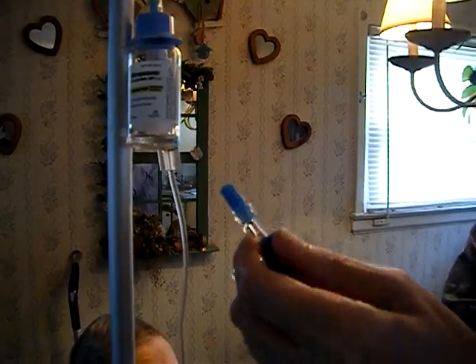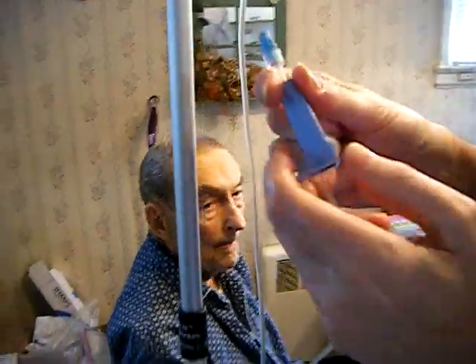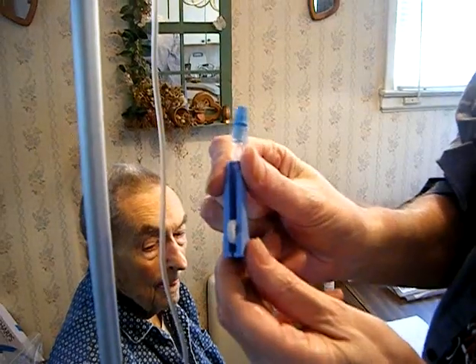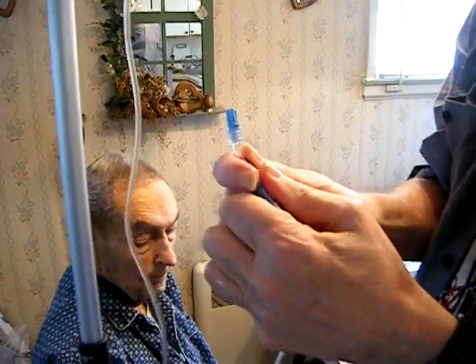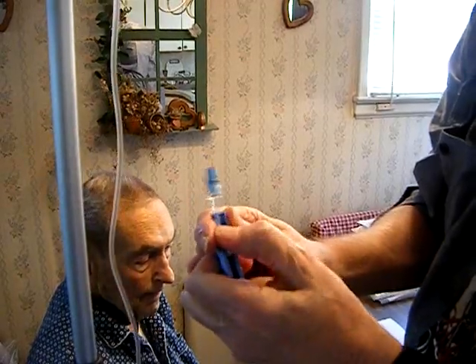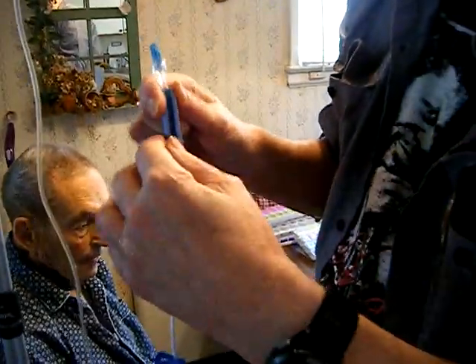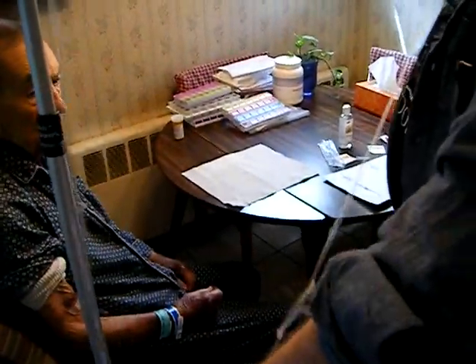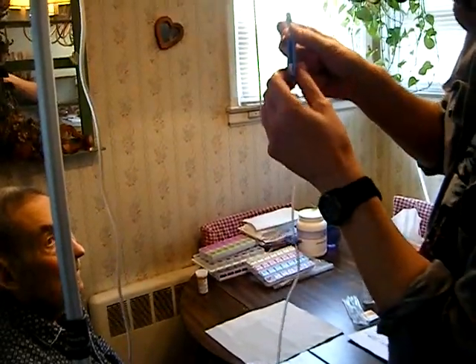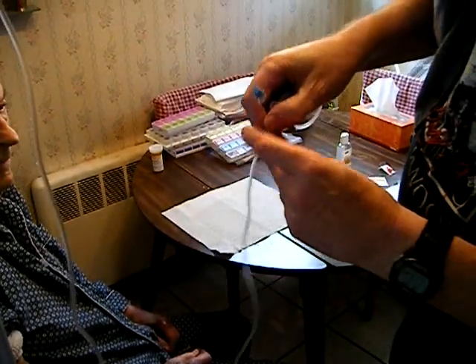It's already starting to flow — I don't have it clamped. There, that'll stop that. There's also this roller clamp — that little wheel either shuts it off completely, slows it down halfway, or opens it up all the way. Right now we're going to leave it in the open position. For demonstration purposes I'm showing this to you at eye level, but we do want to bring it down — it doesn't really matter a lot how far down.